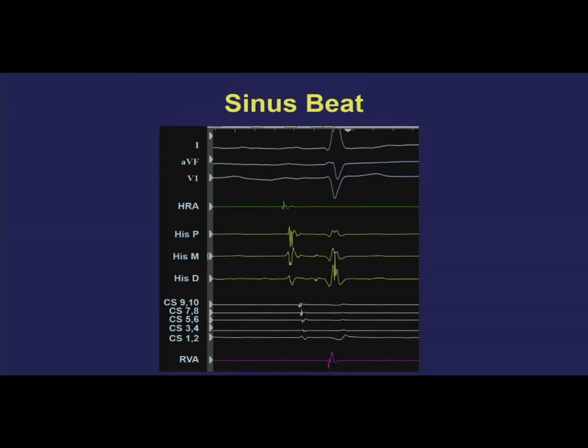That said, maybe you got lucky and you may see a signal in your ventricular catheter just before the surface QRS starts, in which case I would actually measure to that signal.